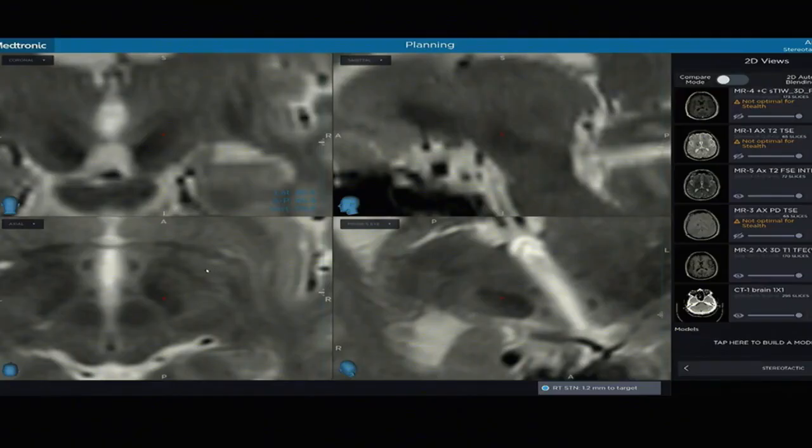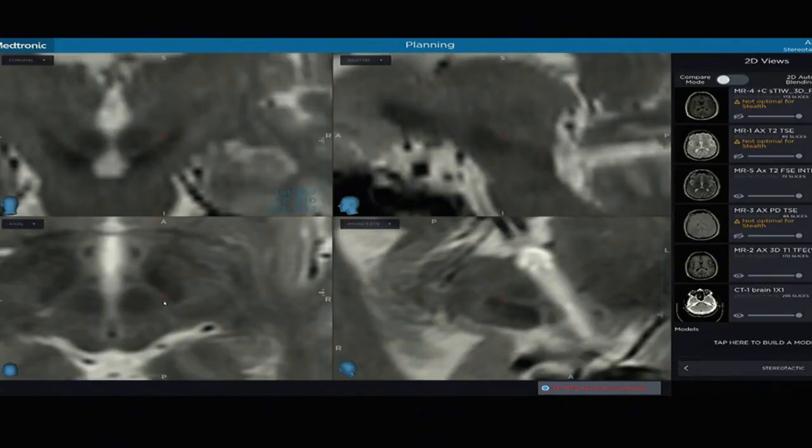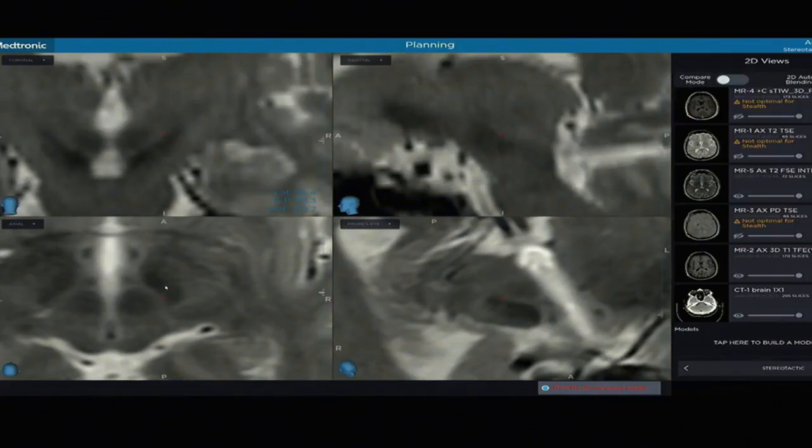If somebody's a high volume surgeon and they know how to target well, the assumption here is that when I say, if I hit this spot or somewhere around this, we're going to get a good result. The assumption is that the surgeon's picking the appropriate target. So I like this spot right here. Say, for example, I decided to go back here, a little bit further back, maybe like 3 millimeters off, and then I got like a 2 millimeter error posteriorly. So it doesn't matter that I hit my target or got close to it. I'm so far off that we're unlikely to get good results.